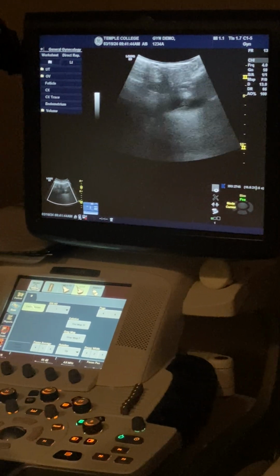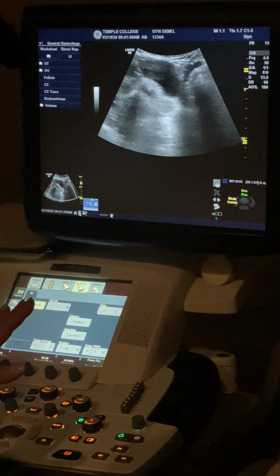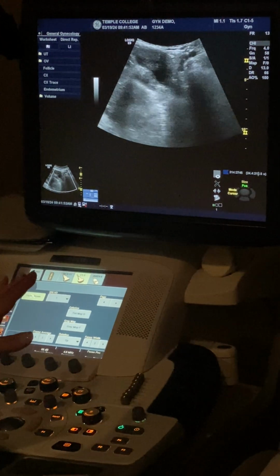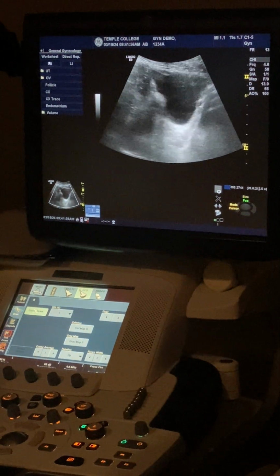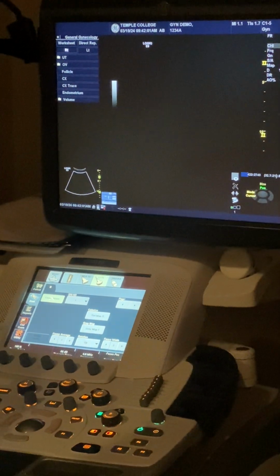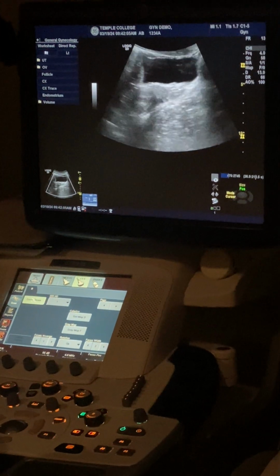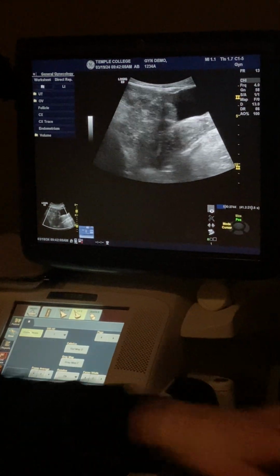I'm just kidding. We're not going to do that. But do you guys see how fast that can happen? The gas moving in your way? But you've got to find a way to get around it. So I am very weirdly, sharply angled at stuff. Do you guys see this? I'm not just staying like here. You're going to have to really work those angles when you're looking to get around gas, okay? Because this is lower intestines that is now our obstacle, not up here.